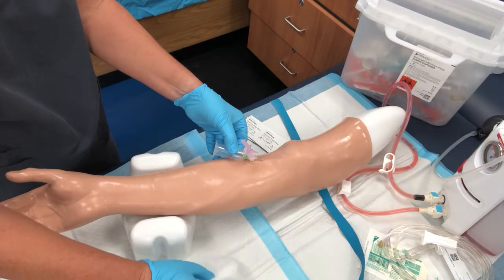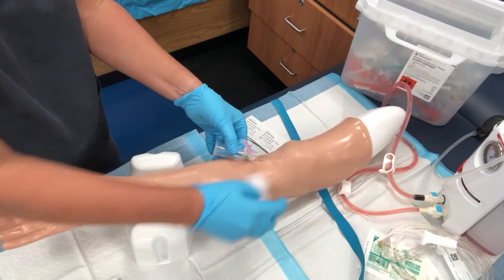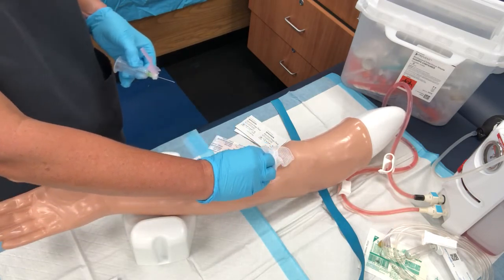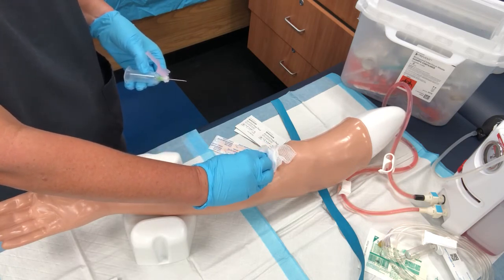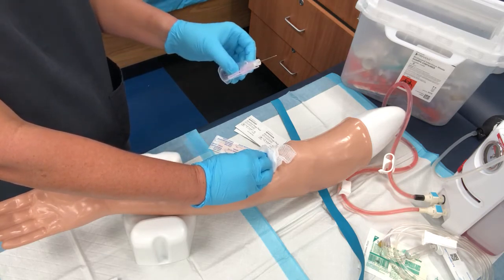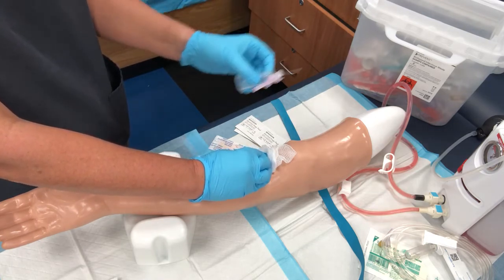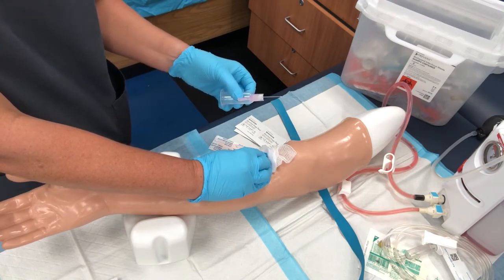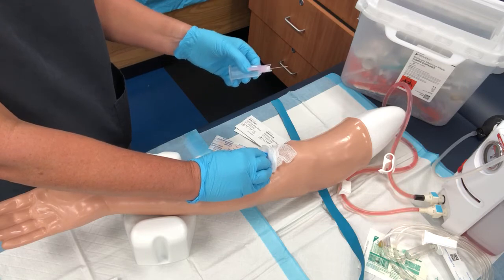Grab your gauze, a 2x2 or a 4x4, whichever you have handy. Put it over your venipuncture site, and in one quick motion, pull out, okay? Again, this is similar to injections. This shouldn't be a very delayed process in terms of pulling that needle out. Now, if you're done using this, you're going to lock your safety device, and it's gonna all go in the sharps container. For the purposes of this, that this was not a real person, I'm gonna go ahead and recap that needle, but again, don't do what I do all the time.